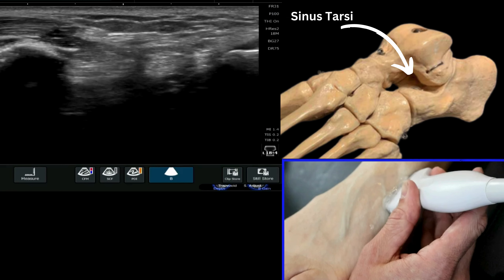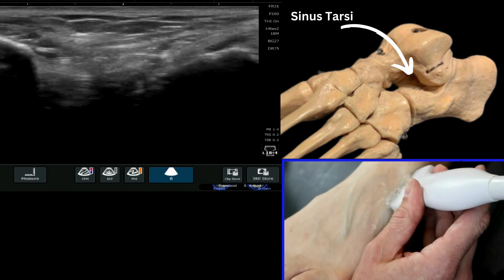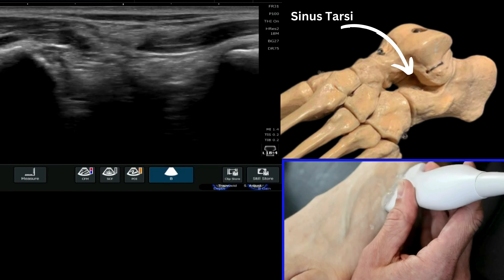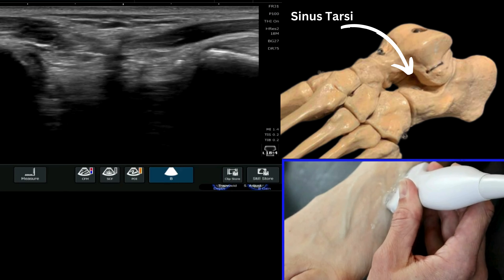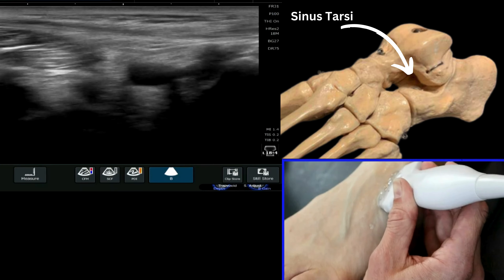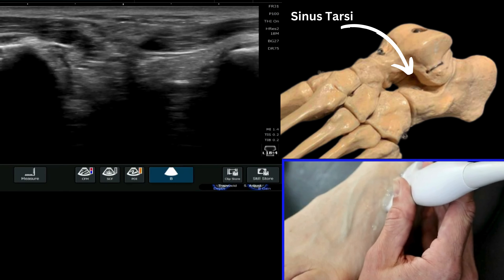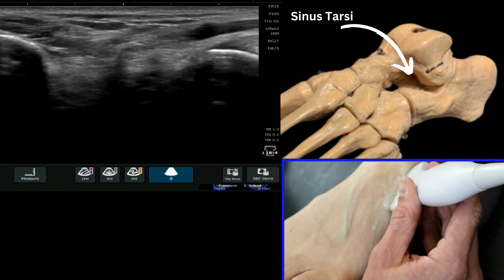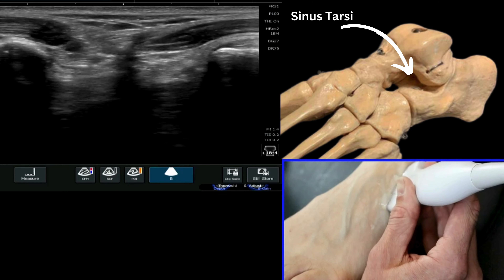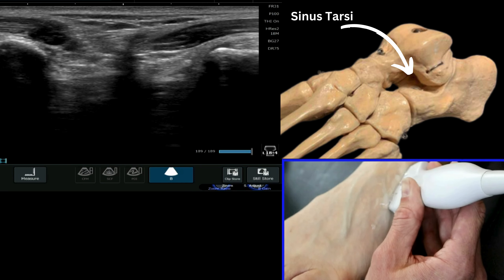We can then come across this void between two quite bright skeletal landmarks. On the right here we have the talus, which we can see here, and the calcaneus which we can see on the left of the image over here. The void in between is your sinus tarsi, and at some points you can identify the extensor retinaculum as well coming down across that. This is now the sinus tarsi in this region here in the middle of the screen.